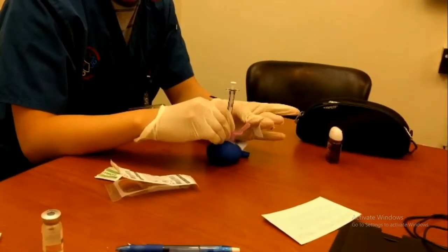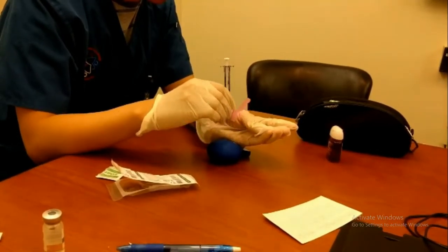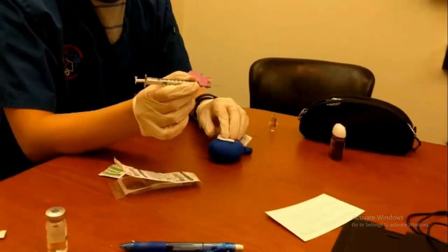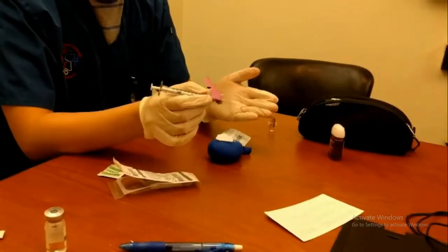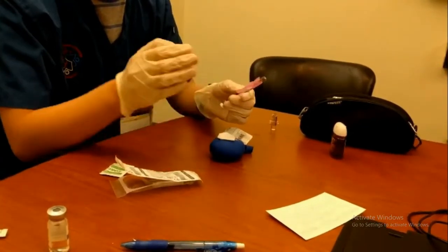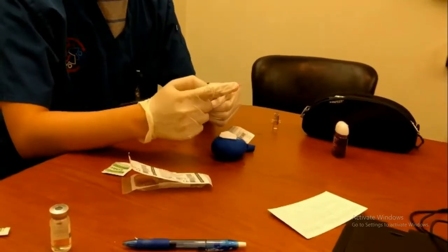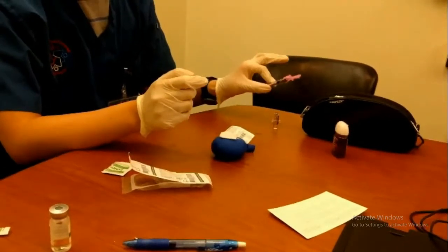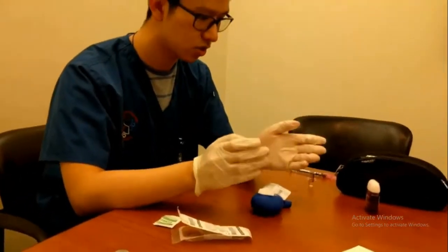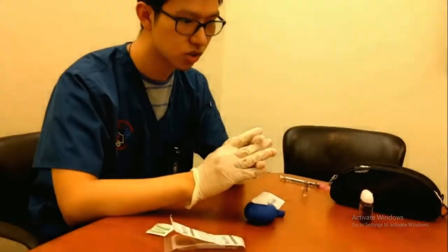Okay, and then I'm going to be taking the needle out slowly and retracting my hand, so then the Z-track closes off the muscle and keeps the injection fluid inside. And then I'll be putting the shield up, over, and I'll be putting that in the sharps bin. For the last subcutaneous injection, I should not have put the cap back on. I should have just put it straight into the sharps bin.